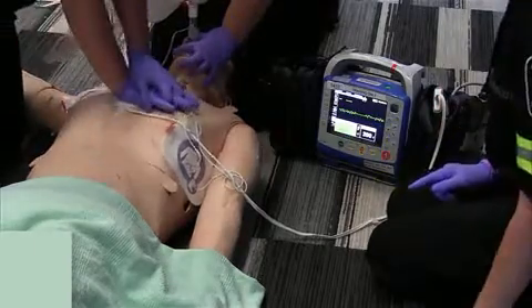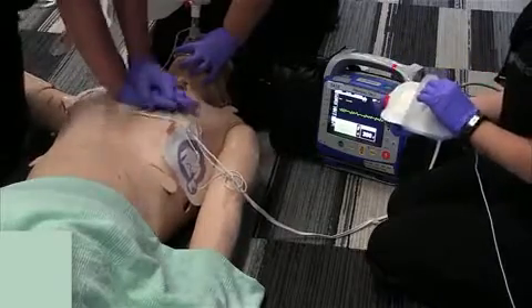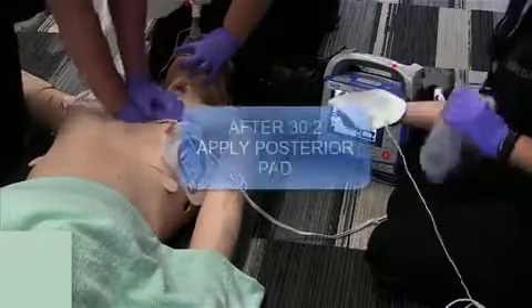Back on the chest. After your 30 compressions and two breaths, we're going to roll the patient towards you.